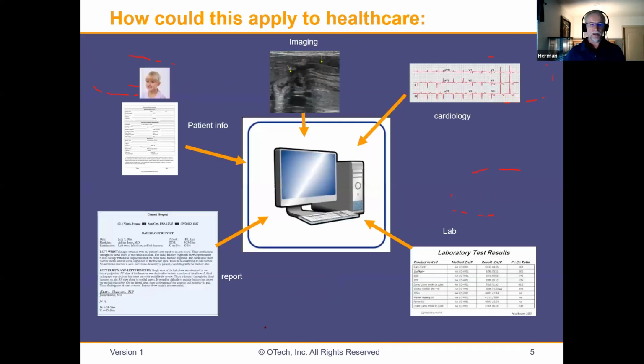Okay, let's say we have an EMR, electronic medical record, and basically I want patient information, no big deal. I have a patient resource. I don't store patient information locally anymore, because what happens if I change it? A typical hospital has at least 20 to 30 ADT feeds. What does that mean? 20 to 30 locations where patient information is managed in a database.